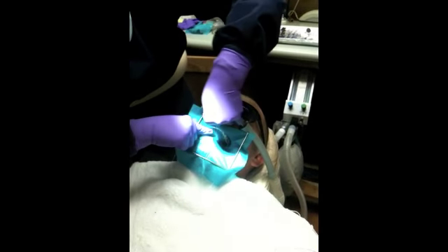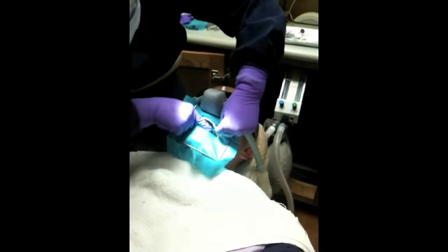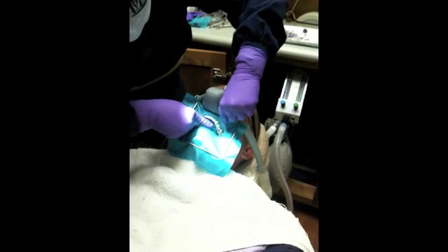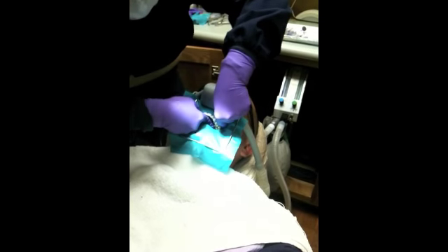A little bit of flossing to get the chicken sandwich out of there for lunch, huh? We already got the chicken sandwich out with the first rubber dam. What are you getting out of there?